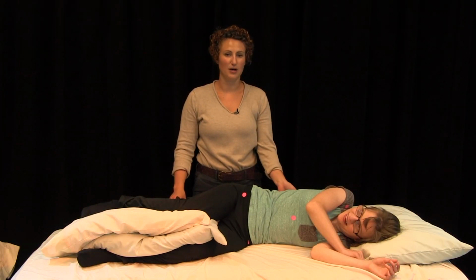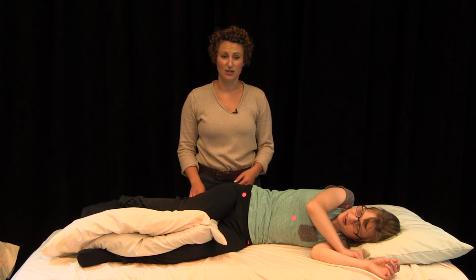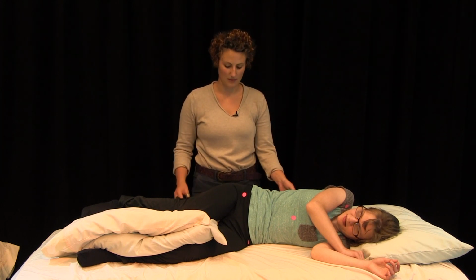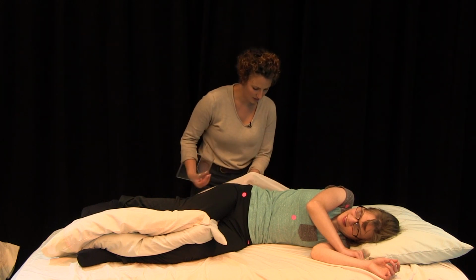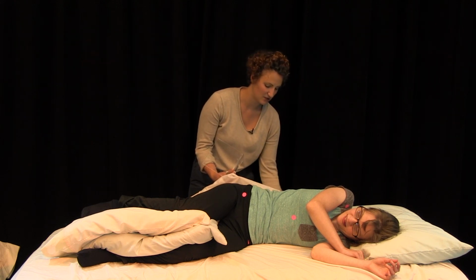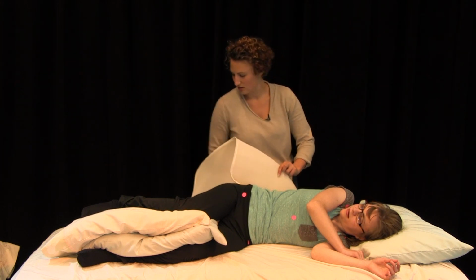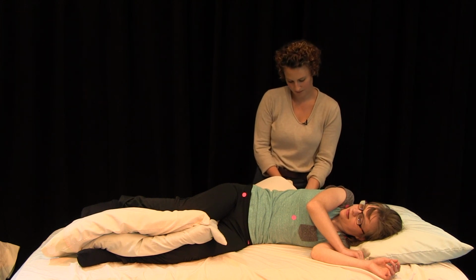Next, provide postural support behind the user's back. This support should be sturdy and placed between the two non-slip layers so that the user can lean back against it without it sliding away. Here we will use brackets, and I'll place them under the cushion layer and between the non-slip. I'll be placing two of these, one against Abby's lower back and one against the mid-upper back.